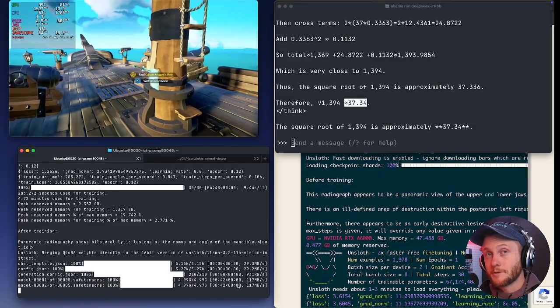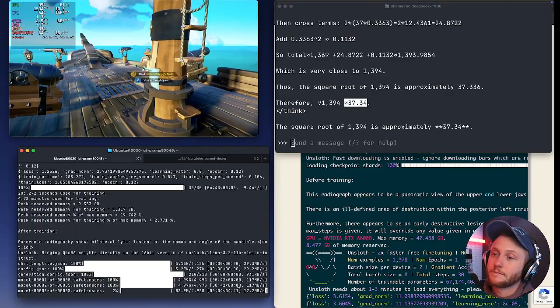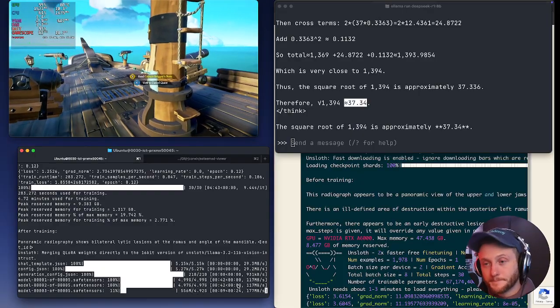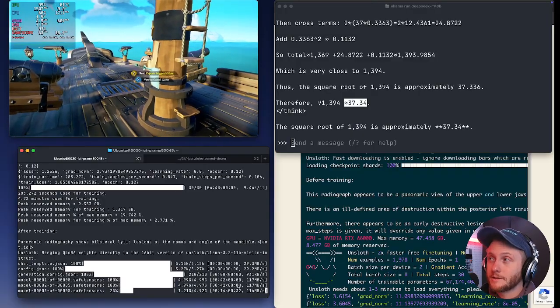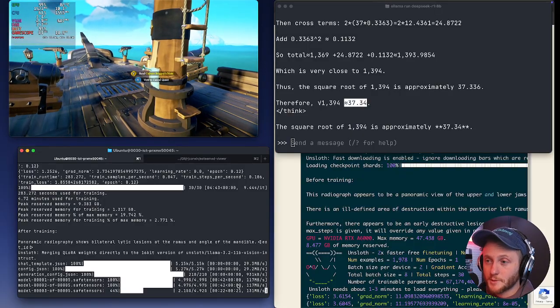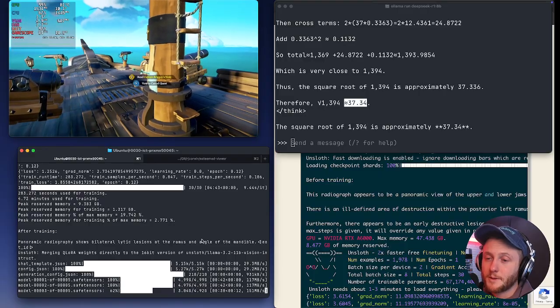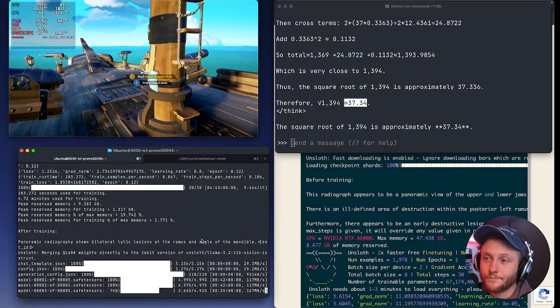Was seeing earlier that there's a way to utilize Ollama to use custom models from Hugging Face on Ollama, which would be handy because that comes with a HTTP API, and it comes with, you know, just a way to kick the tires quickly. There's probably a Hugging Face way to do that too, though. Could go that route.